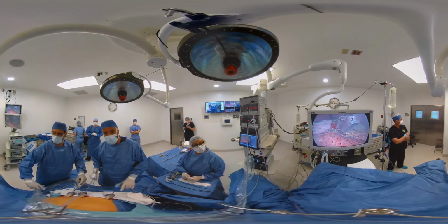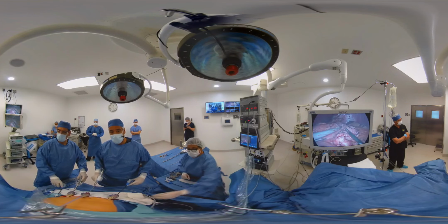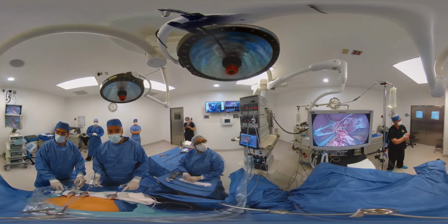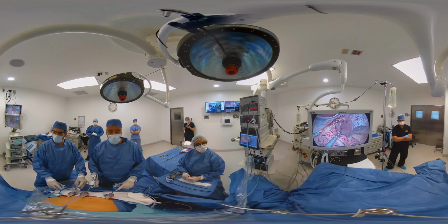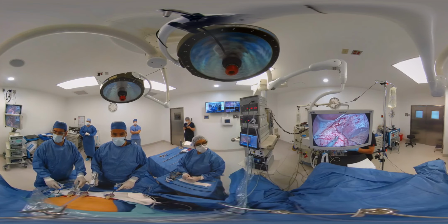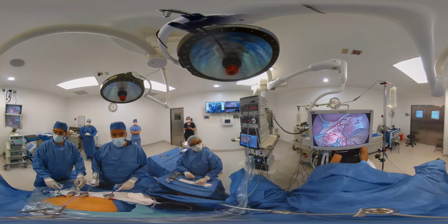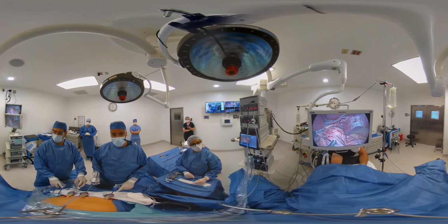So we've separated the stomach fully. This is the stomach. This is a very big stomach, of course. And we've got the hiatus. Basically, the hiatus is where the stomach joins the esophagus. As you can see, we can move it back and forth nicely. We're going to ask the anesthesiologist to pass down a tube through the throat and we're going to use that as a calibration device. So right now, pay your attention on the screen. Go ahead and move your mobile devices or your screen, drag it.